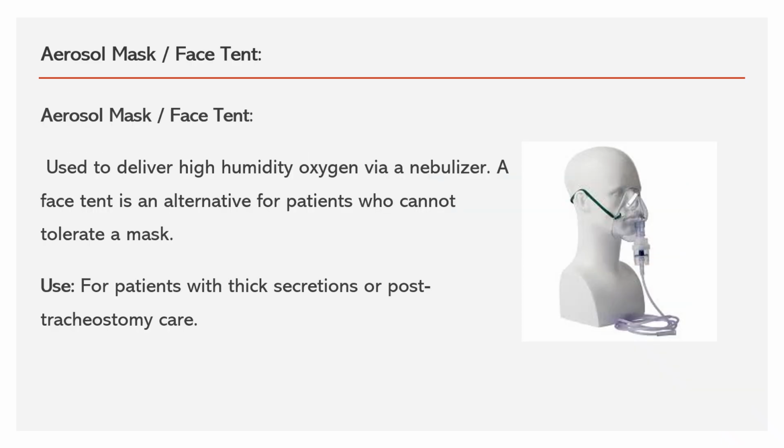Next is the aerosol mask or face tent. This mask is commonly called a nebulization mask. It is used for delivering high humidity oxygen via a nebulizer. A face tent is also an alternative method for a patient who cannot tolerate the mask while giving the nebulization.